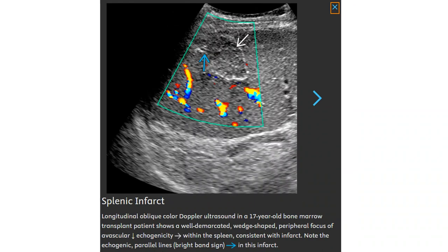This is a color Doppler ultrasound in a 17-year-old bone marrow transplantation patient, showing well-demarcated, wedge-shaped peripheral avascular areas of decreased echogenicity within the spleen, consistent with infarcts. Note the echogenic parallel lines in this region.